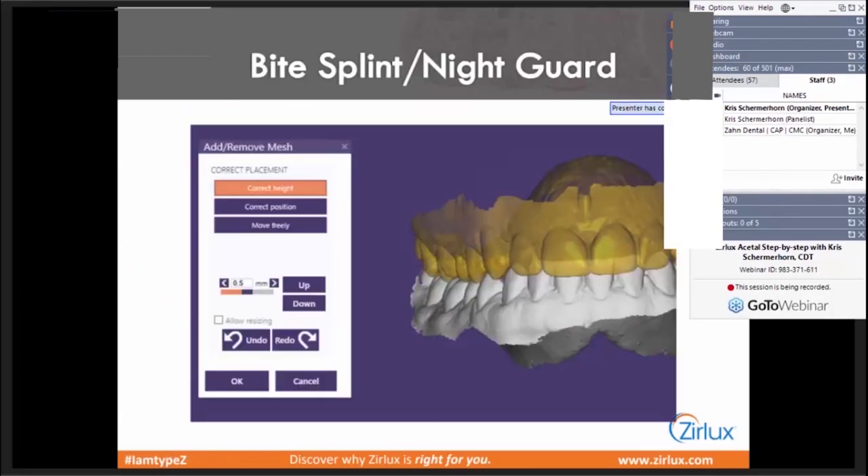Bite splints, night guards — nothing special here. This is a cool thing. When you get started with this and you're like, I don't know about the framework or the Smile Composer — bite splints are simple because they do everything you've already done. If you've done bite splints out of PMMA, do the exact same thing. Just load the Xurlux Acetal into the mill instead of the PMMA.